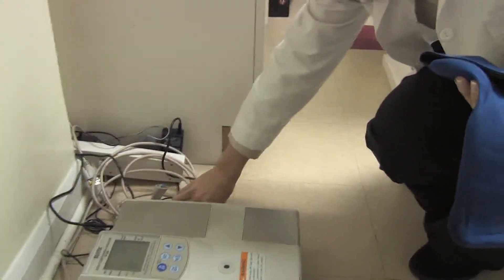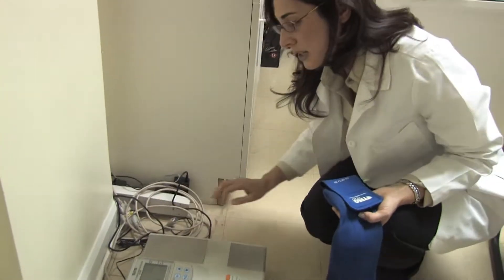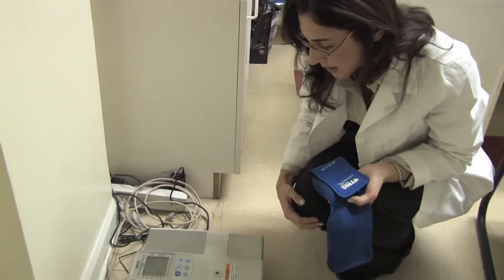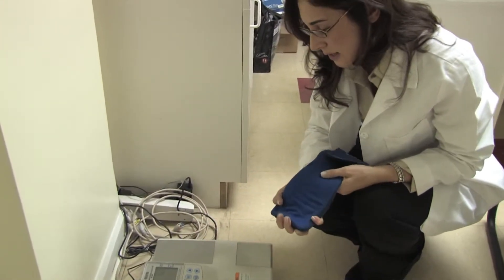In addition, you want to make sure that your scale is on a flat surface. You don't want it to be uneven and you don't want it to be on a rug. Make sure that it's laying flat and zeroed out before you do any kind of measurement.